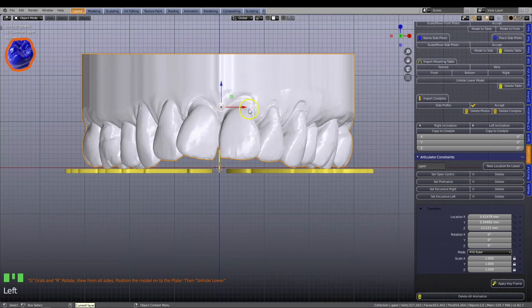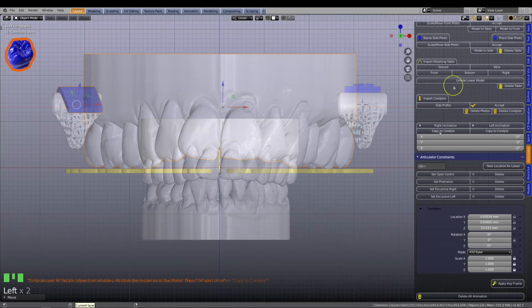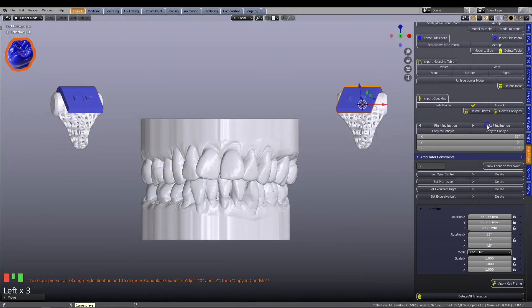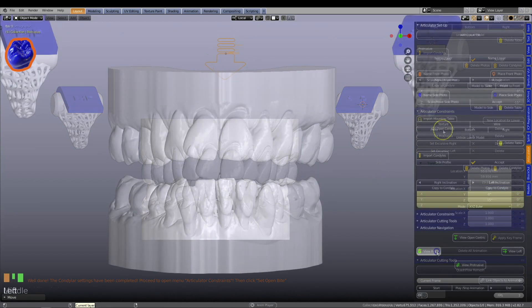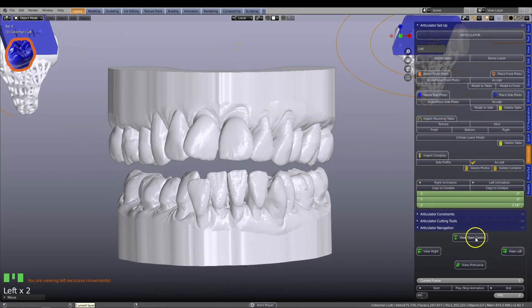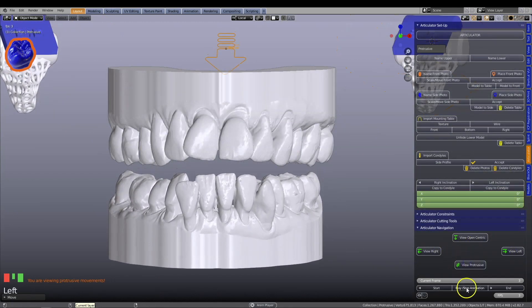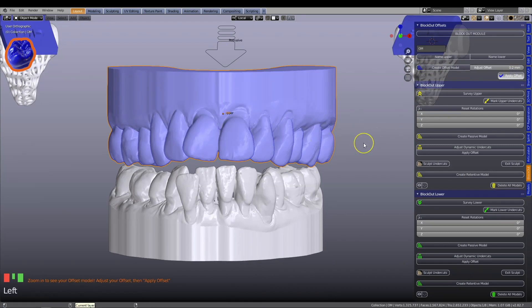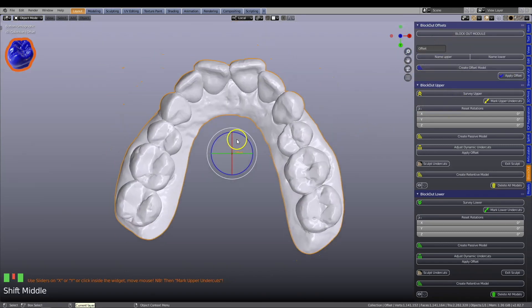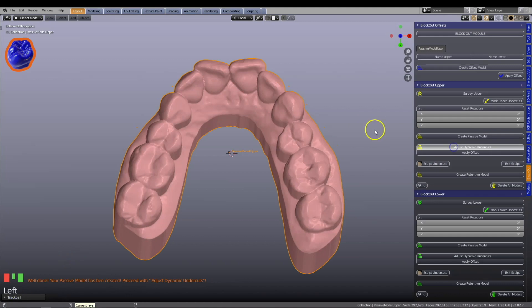The Blender for Dental articulator module is used to animate the movements of the lower jaw. The Blockout module is then used to create the retentive model required for the splint.